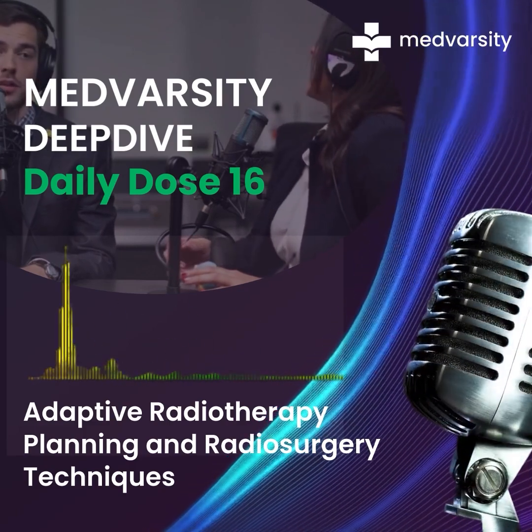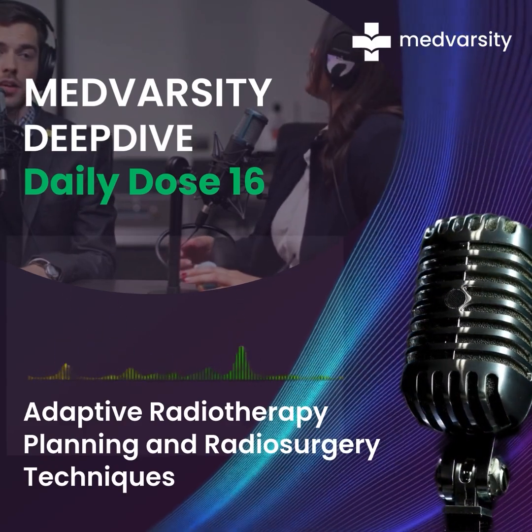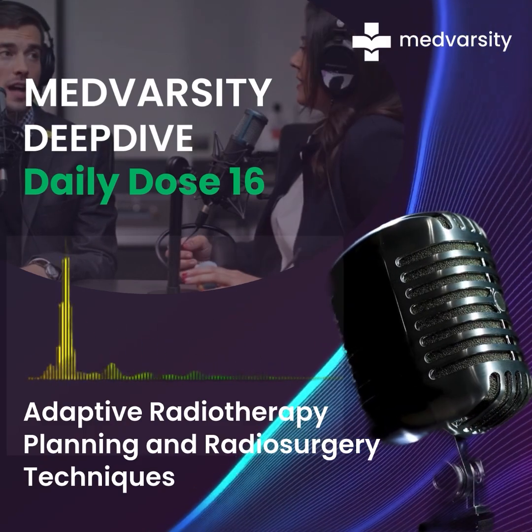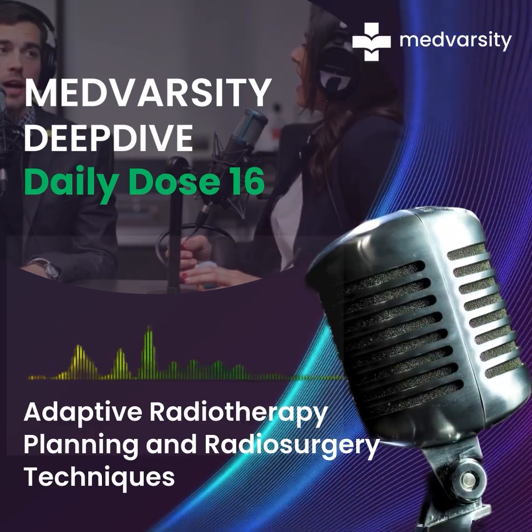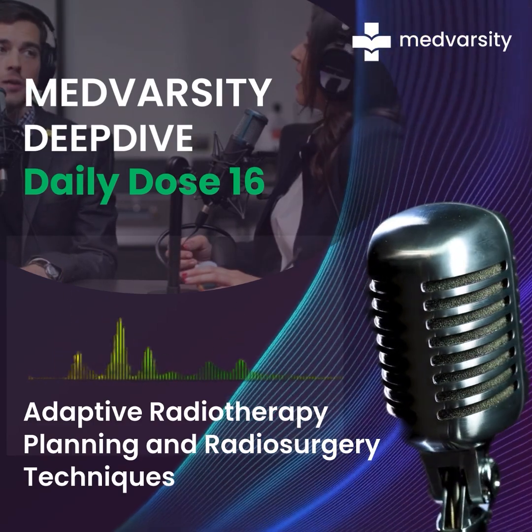And because we have such precise targeting, we can give higher doses in fewer sessions with less damage to that surrounding tissue. So it's like a surgical strike with radiation. Get in, hit it hard, get out. Exactly. And we have two main ways to deliver this type of therapy. One is with a gamma knife, and the other is with a cyber knife.